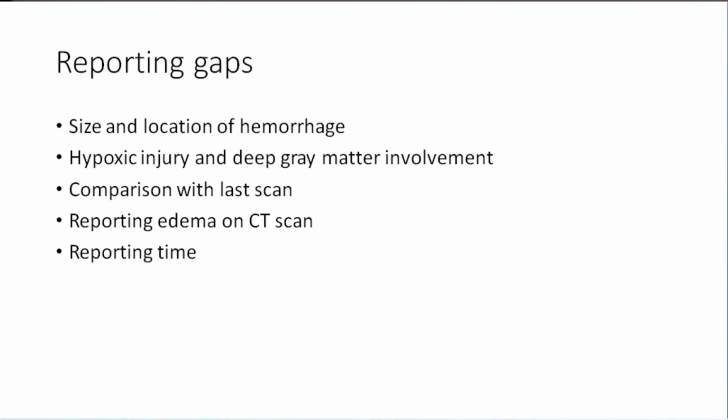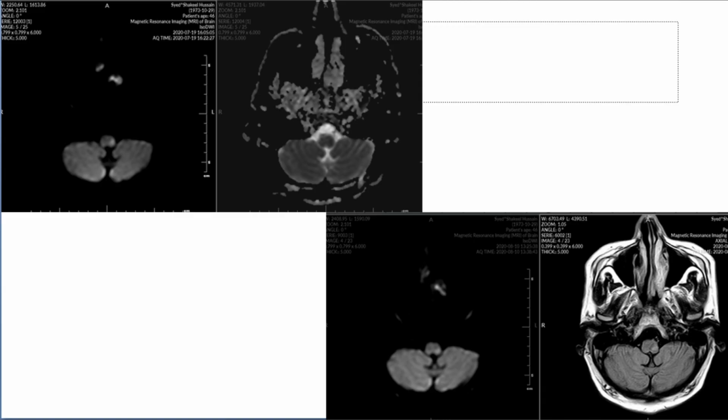So for the sake of time, this was the stroke. Only on one section, on DWI. Okay, we proved it clinically. I have the video, I'm not going to show you guys, but this was the case, and here it is. And then we did the repeat scan on this patient.